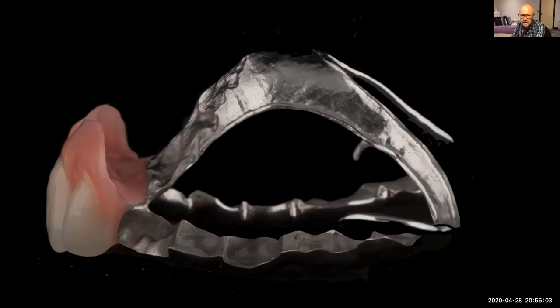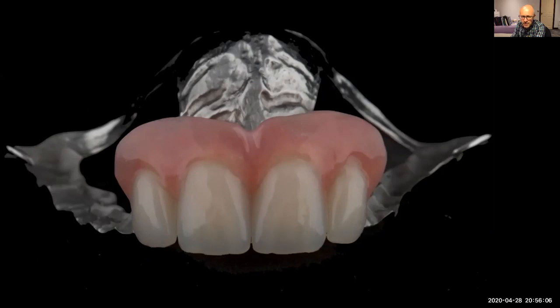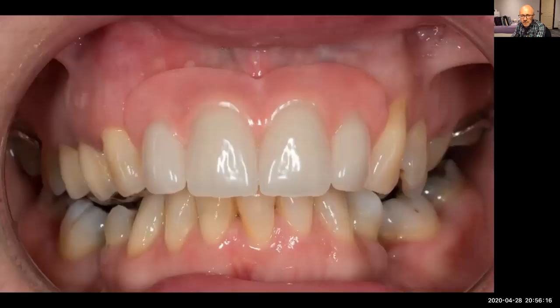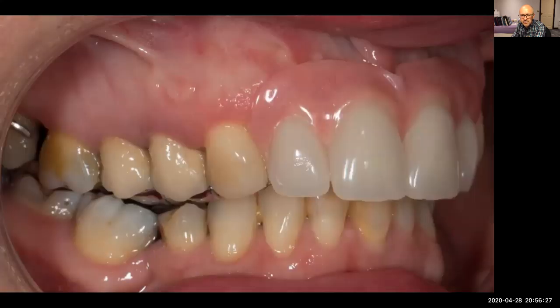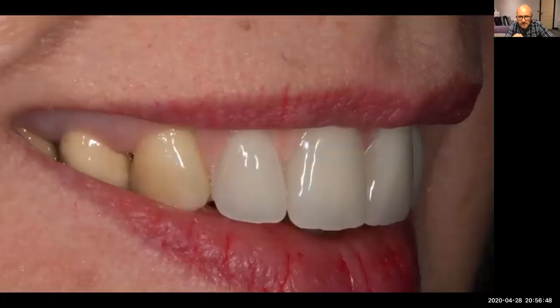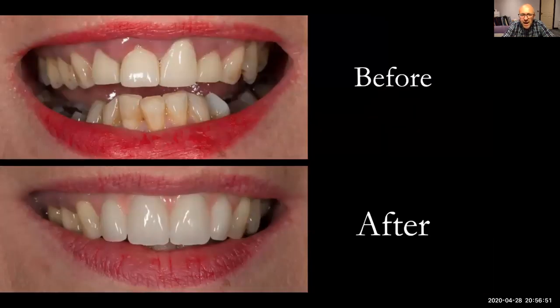But this is Wendy's denture, beautifully finished, with a little bit of wear on the anterior teeth. It fitted really nicely. It was really comfortable straight away. No problem with opening the bites either. Canine guidance, comfortable, even occlusion, and nicely protected upper teeth. Those heavily restored upper teeth with crowns and big fillings, all protected. Anterior path of insertion is crucial here for getting this lovely junction between the flange and the tooth, both sides. Big gummy smile, high smile.